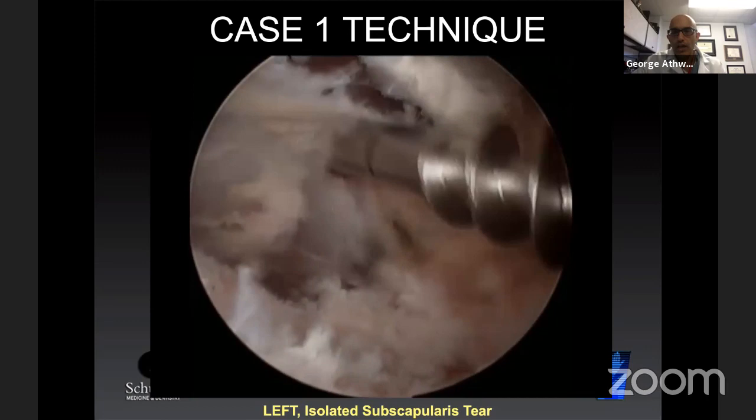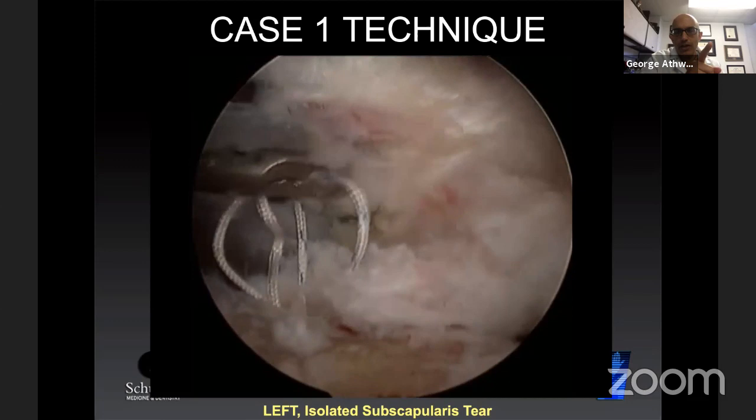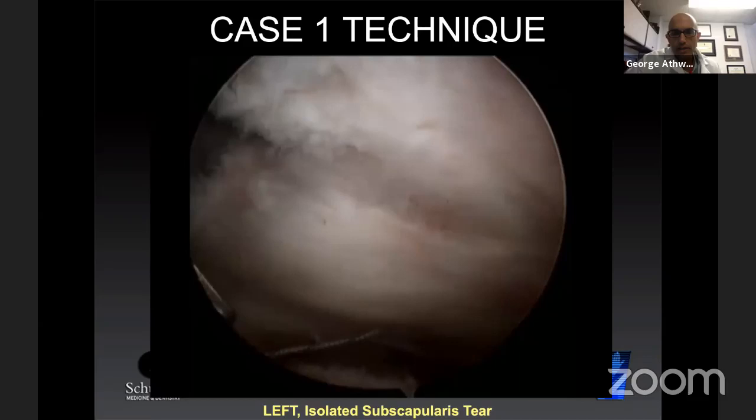In this video, I'm showing three anchors being placed in line. Now I've changed it so that I place the inferior anchor more medially, the middle anchor slightly more laterally, and the proximal anchor slightly more medial. So it almost gives a zigzag pattern, like a pseudo double row, where I'm dispersing the tendon a little across the tuberosity. I typically like to pass my sutures from inferior to superior.